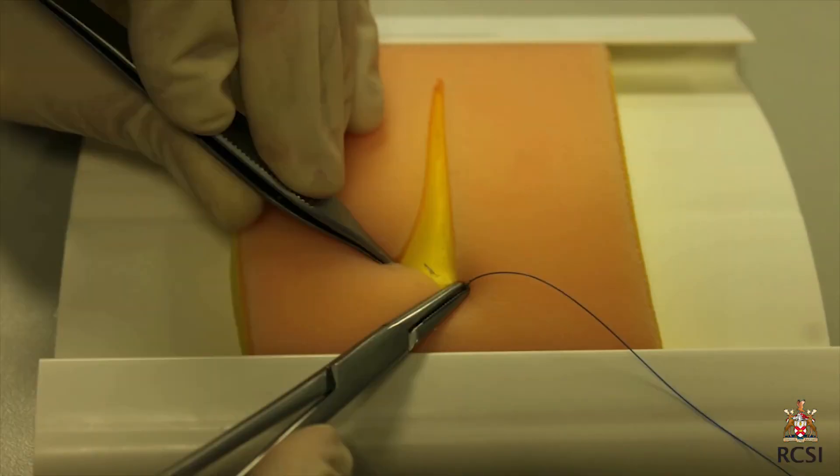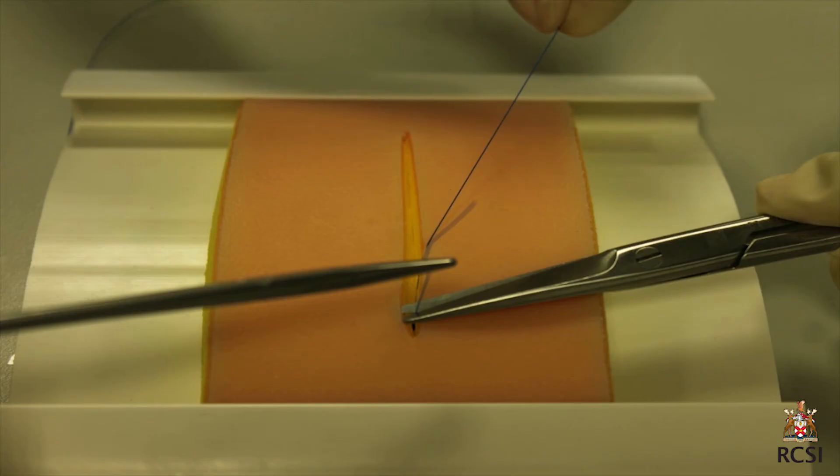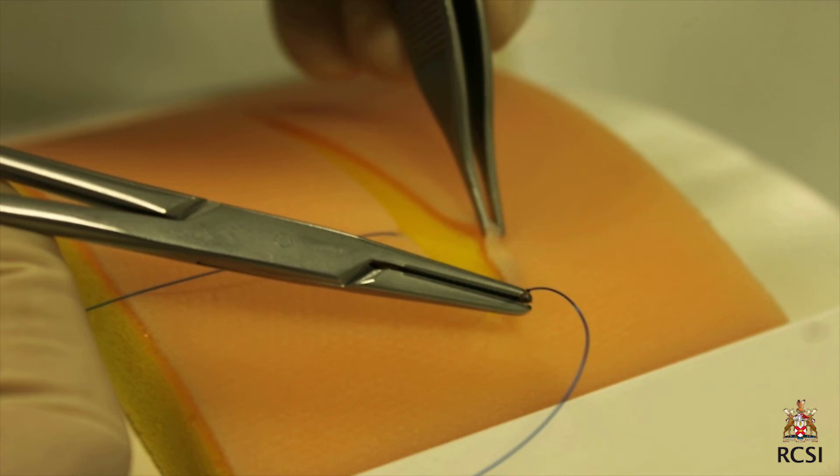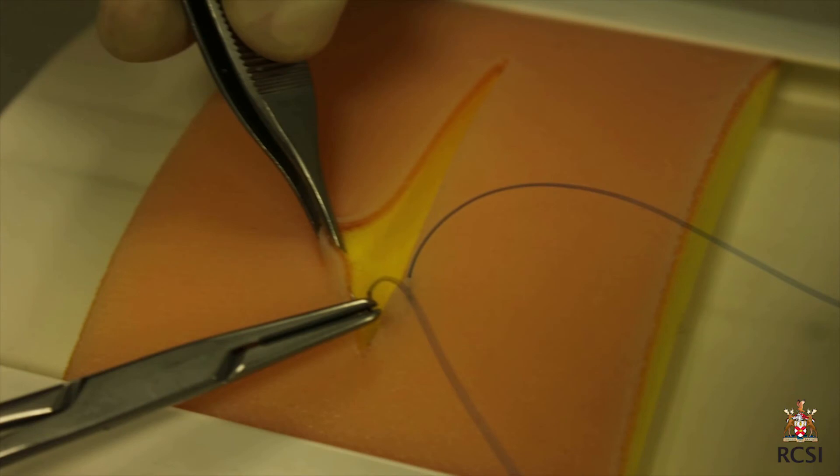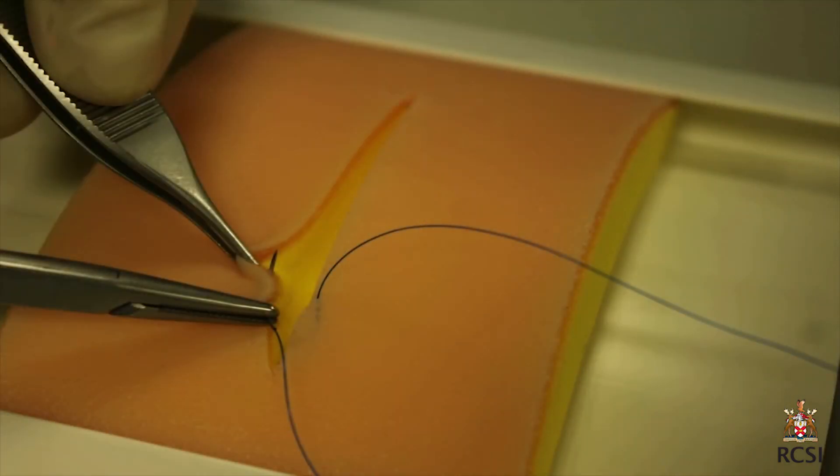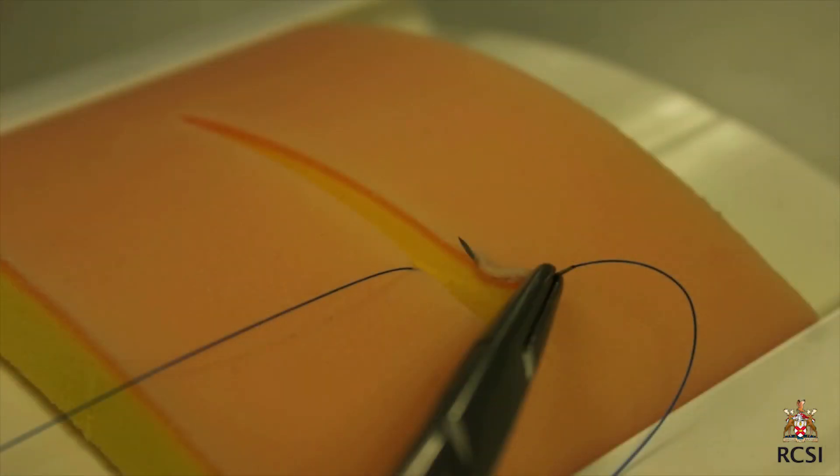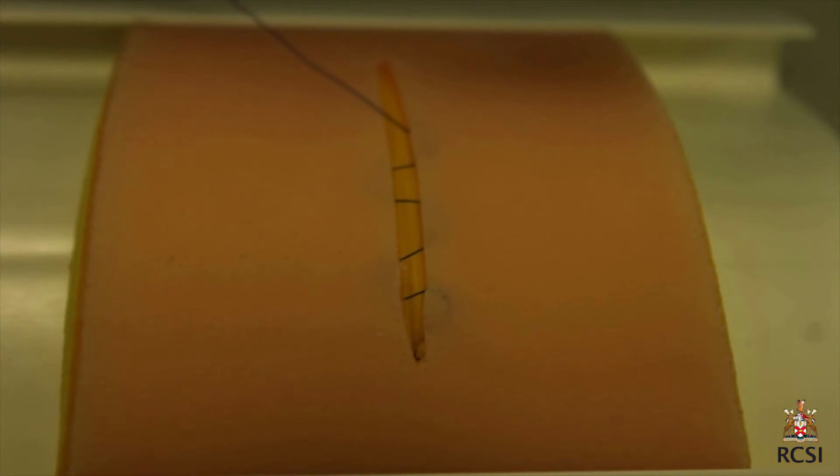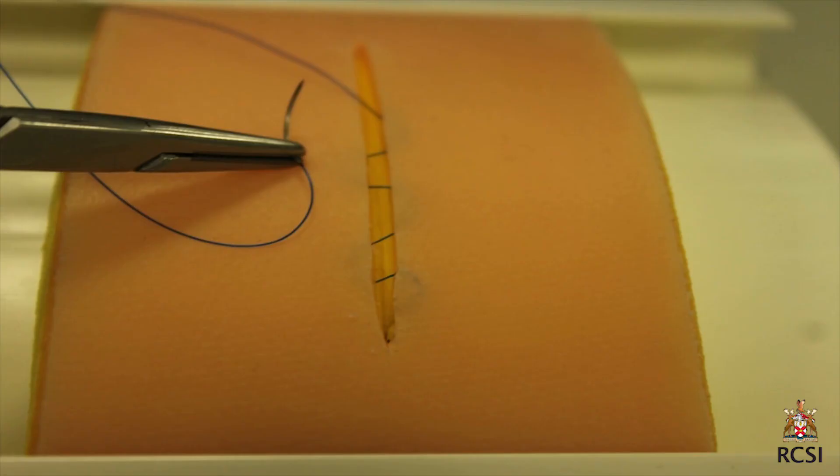The first knot is placed at depth. The short end is cut just below the skin edge. The needle is rotated through the mid dermis only. The next stitch is placed opposite to where the last one exited the wound. Each stitch is of equal size. Each stitch is of equal depth in the dermis. The wound is pulled closed intermittently after every 3-4 stitches.